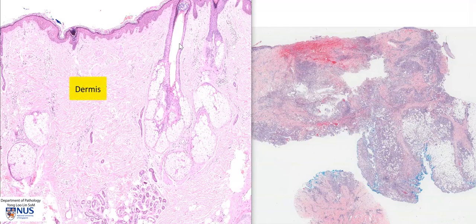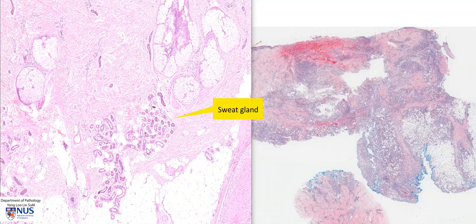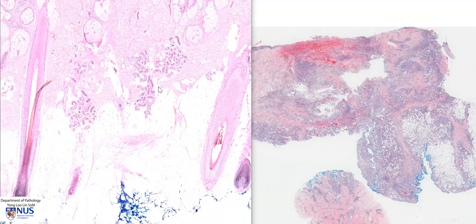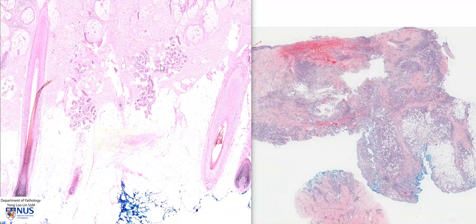Within the dermis, we can see hair follicles, pilosebaceous units with the sebaceous glands here and the hair follicle. We can also see some adnexal structures, such as sweat glands, and then deep to this, we have the adipose tissue that forms the subcutis. You can see that some of the hair follicles also extend into the subcutis.